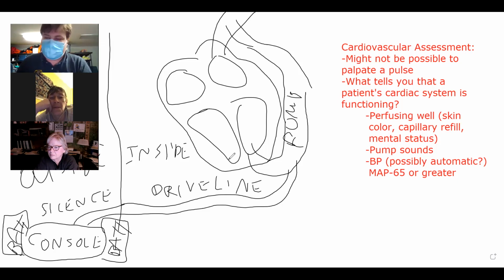If the patient is in full cardiac arrest, which would be suggested by a completely unresponsive patient who has terrible signs of perfusion and is not breathing effectively, CPR should not be performed if there is any evidence that the pump is still functioning. The decision on whether to perform CPR should be made based upon best clinical judgment, which means, are you not able to fire up the ventricular assist device? Listen over the heart, see if you can hear the thing running. Are there indicators on the screen that suggest it's on and working? Have you tried some of the obvious mechanical things to get it fired up again?